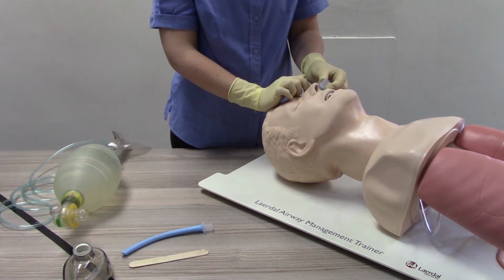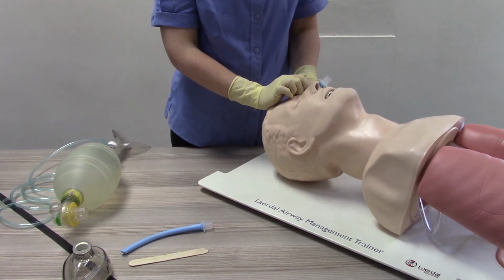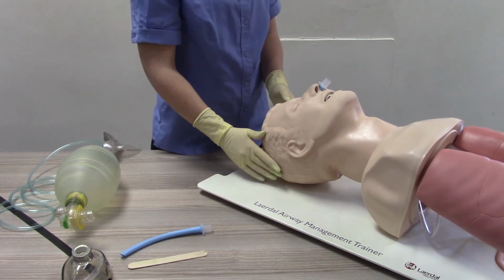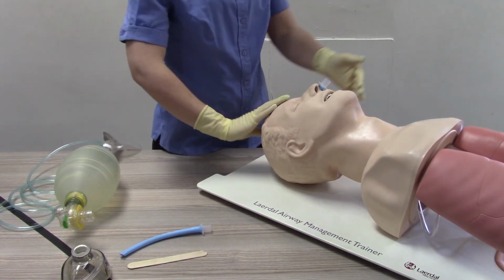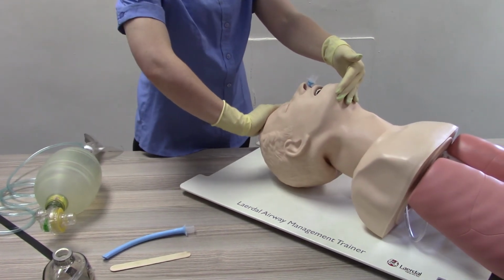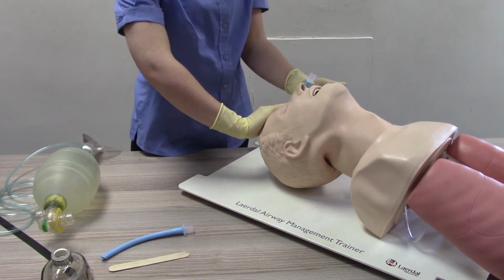Step 4. Ventilation. Position yourself directly above the patient's head. Perform a head tilt chin lift. Place one hand on the patient's forehead and push with your palm and tilt the head back.